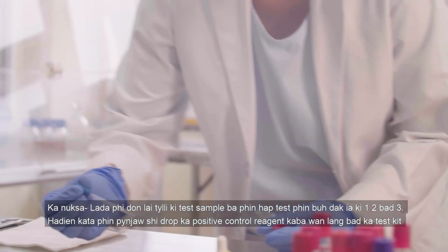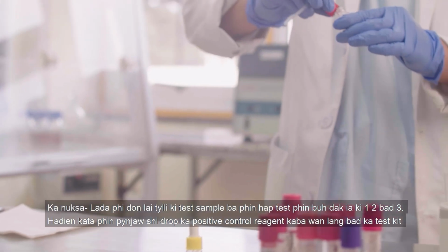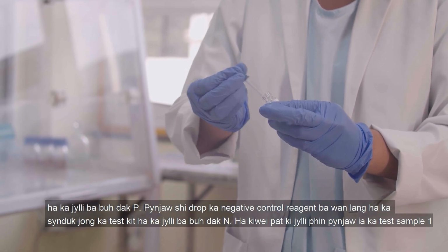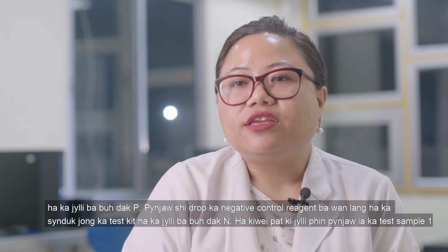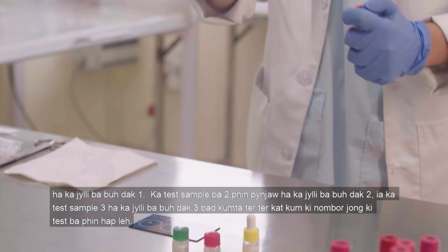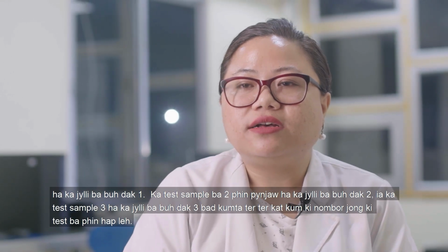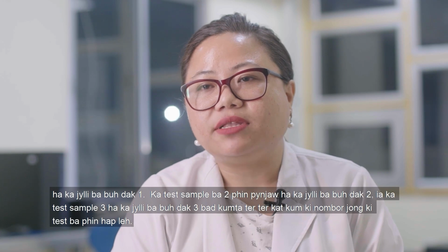Next, you will add 1 drop of positive control reagent that has been provided in the test kit into the circle labeled P. Add 1 drop of negative control reagent provided in the test kit box into the circle labeled N. In the rest of the circles, you will add test sample 1 into the circle labeled 1, test sample 2 in the circle labeled 2, test sample 3 into the circle labeled 3, and so on, depending on the number of test samples that you have.